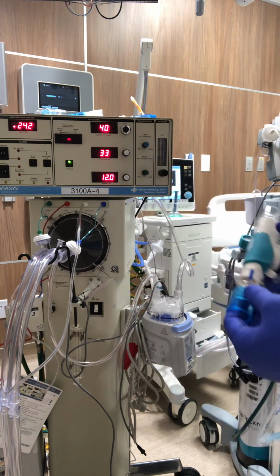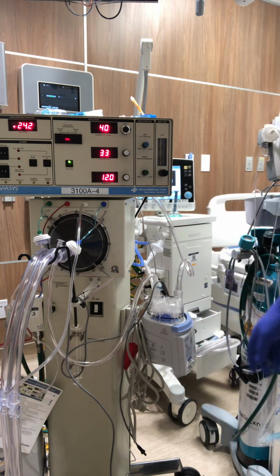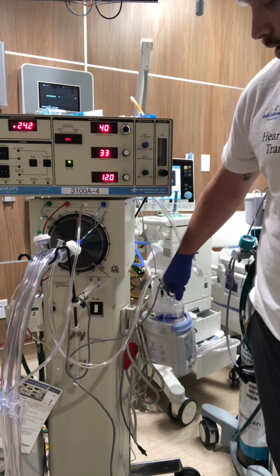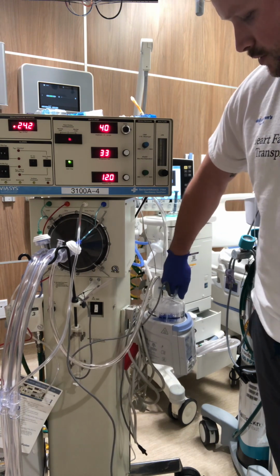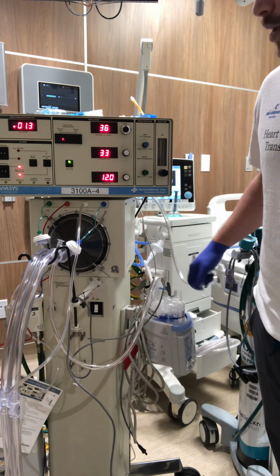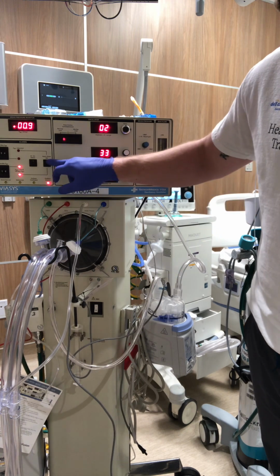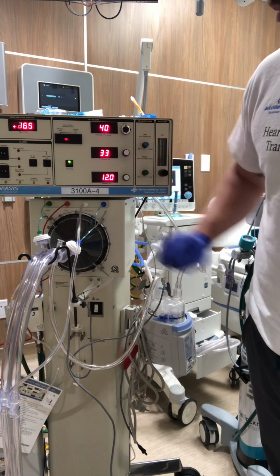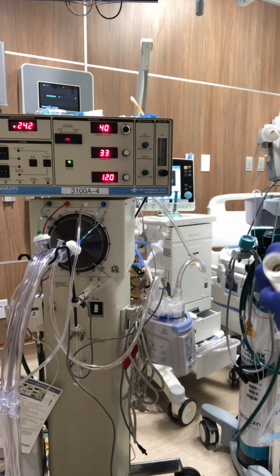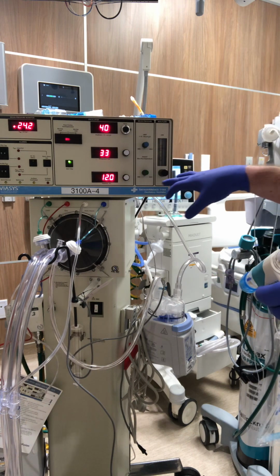once you fix the leak that you created by adding your injector module. So real quick, just a quick refresher: anytime there is an excessive leak in your oscillator, it alarms and then shuts off. Fix the issue, the leak, hold down reset power fail, and that repressurizes the system and then turns your oscillator back on automatically with the same settings that you had before that issue happened.